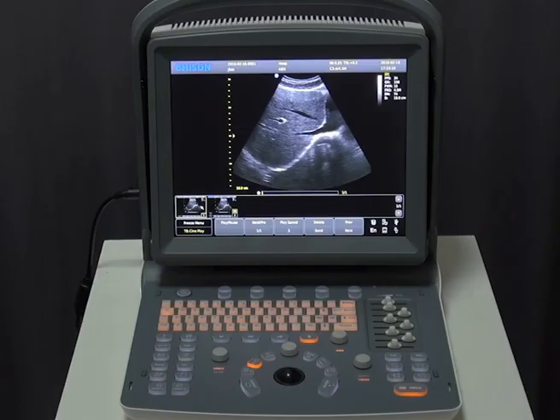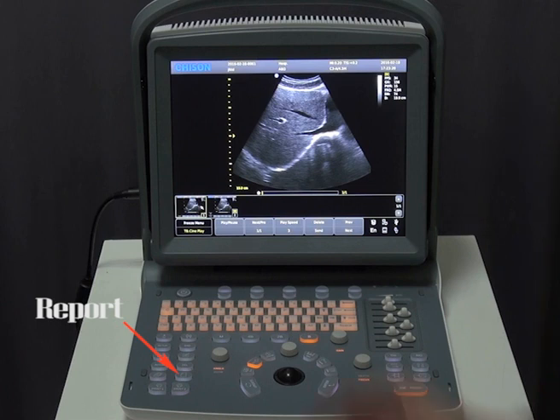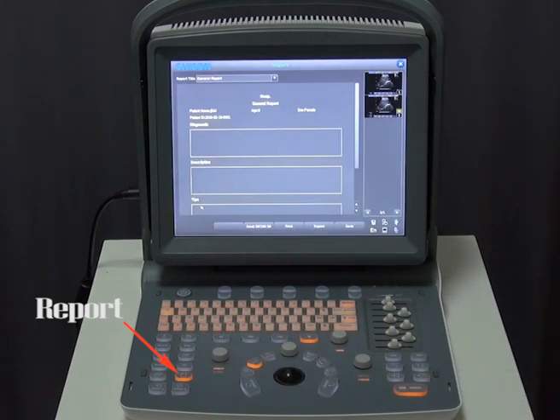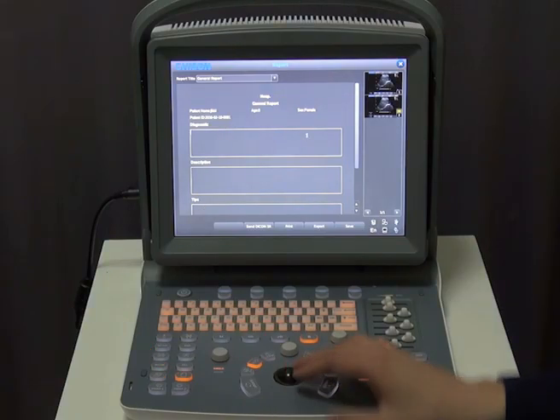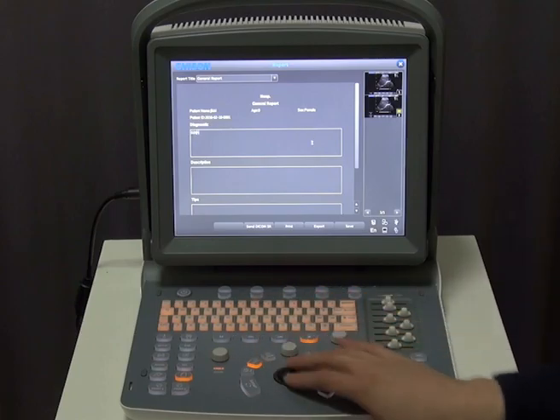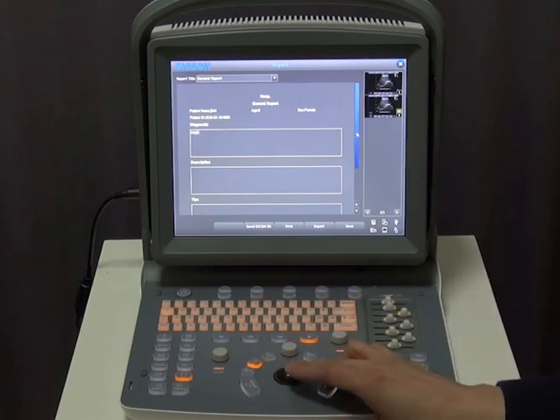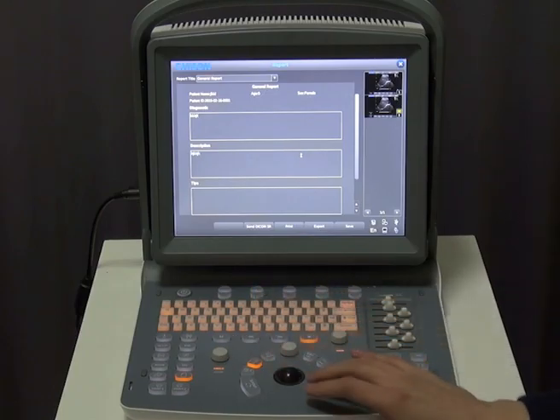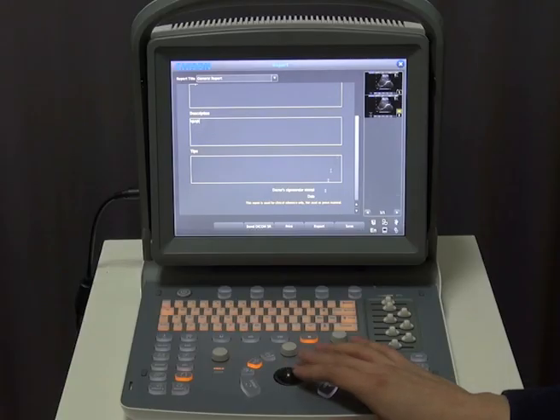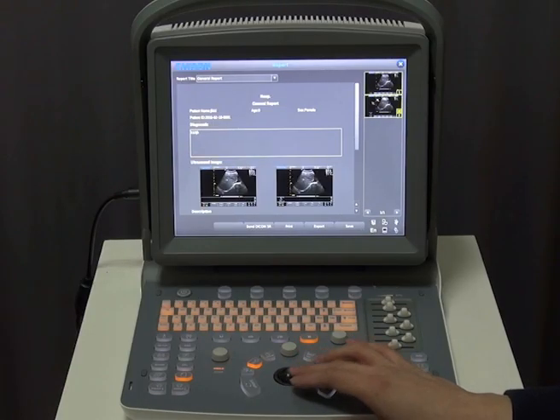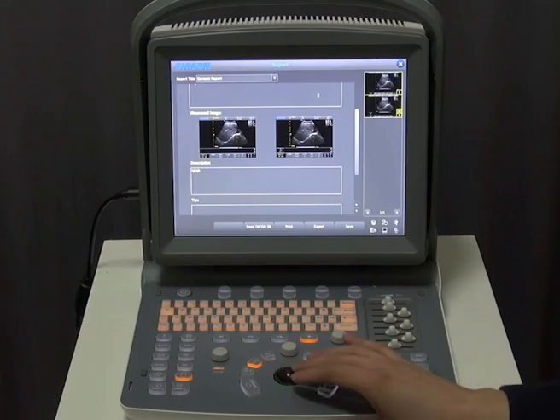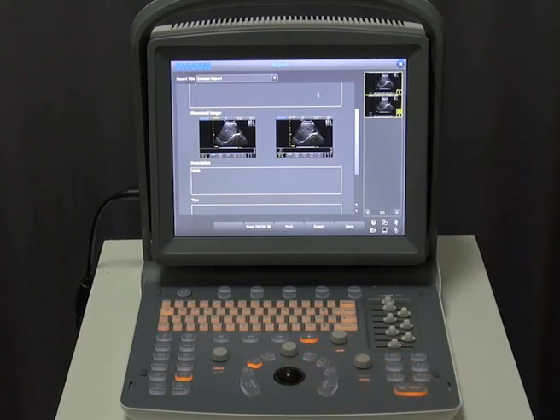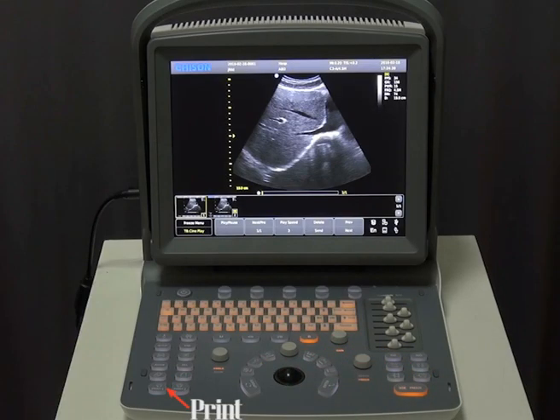Now let's generate a report. This document icon takes us to the report page, which shows the full report and all measurement results. You can type in the box to edit the report, add patient information, click Exit, clear measurements, or show a graph such as an OB report. You can also add images to the report by clicking on them. Press the print key to print the report in different formats.